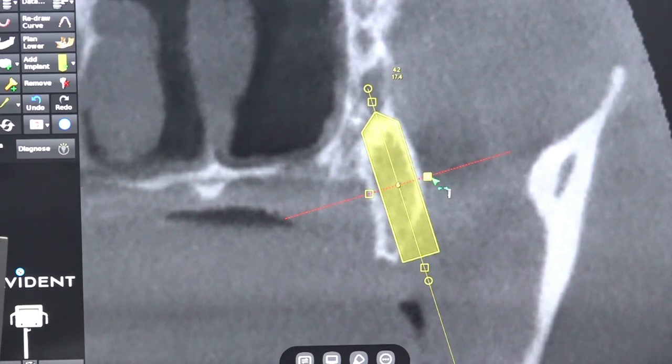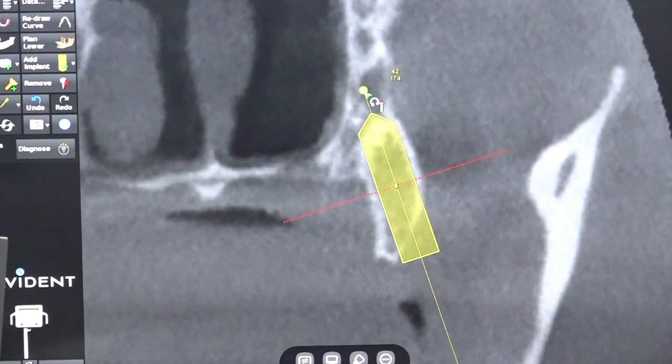So use a very thin diameter implant, say 3.3 or 3.5, something like that. Either Neodent 3.5 or JD Pterygoid 3.3 you can use for safety, otherwise the alveolar bone will mash up, the tuberosity will mash up, it will crack.